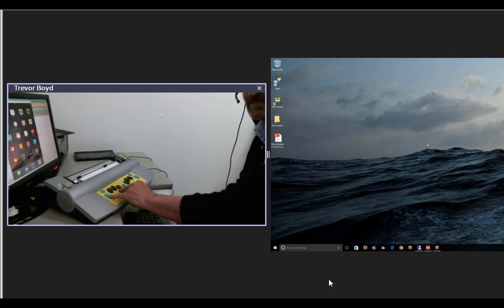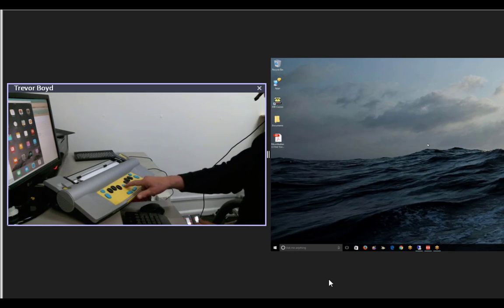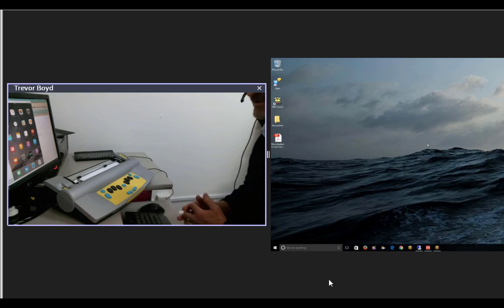It has a couple of additional features. They can be simple things like correction. So if I Braille an L, but I really meant, say, an A, there is a backspace key here, which is this one on the extreme left, and I just do the key I want, and it will now correct that and put the corrected cell in there.